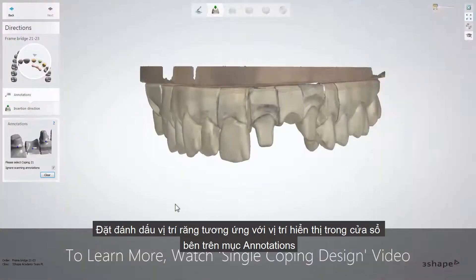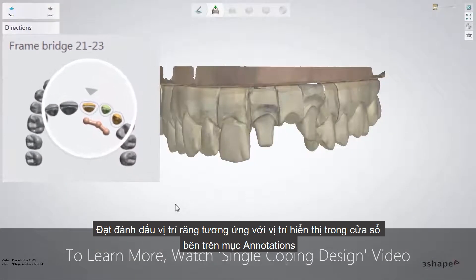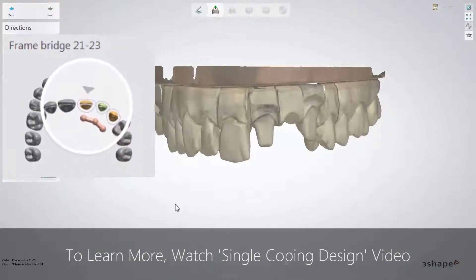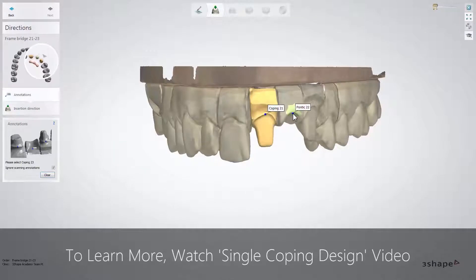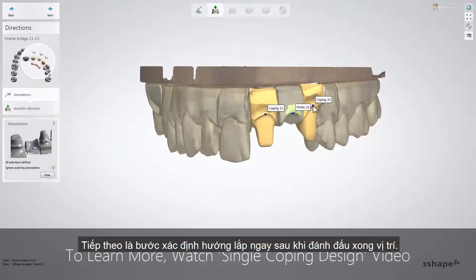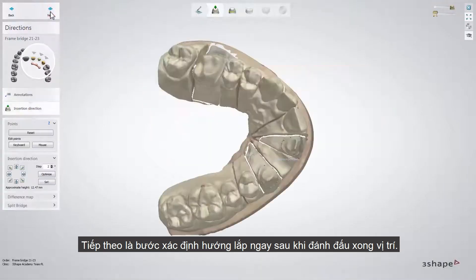Place annotations in sequence shown in the overview window. The insertion direction step comes next after annotations.